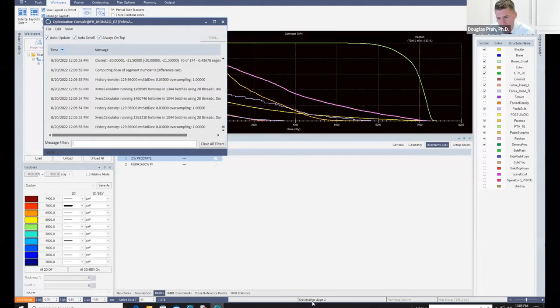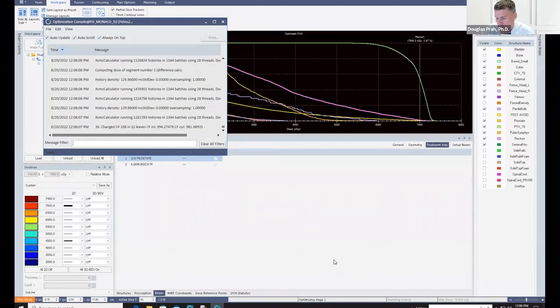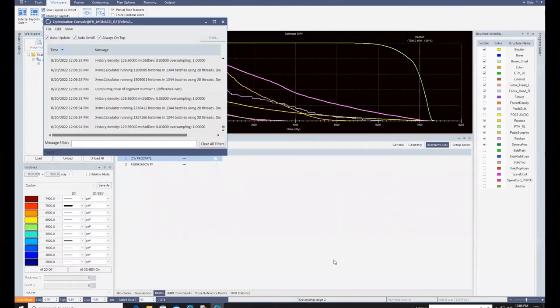And yeah, if it's a really large volume, that's usually when I see that happening. For example, we do a lot of breast IMRT plans, and if the breast volume is too large and at one of the gantry angles you can't see the entire PTV, then you'll usually get optimization halted. So then we have to move the isocenter around to get it to a point where it's not going to cause that violation.